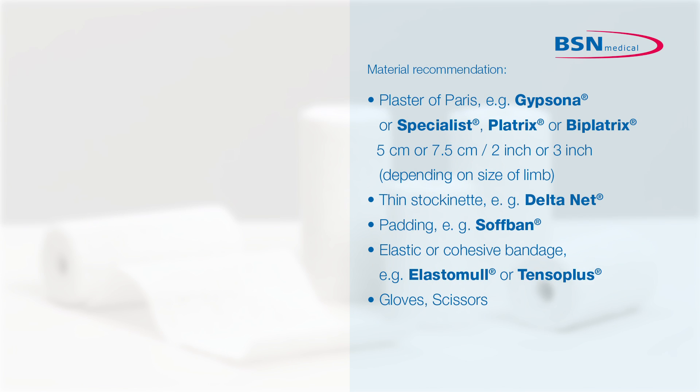Define the position of the limb before the start of the application. This will give the patient an indication of which position he has to maintain.